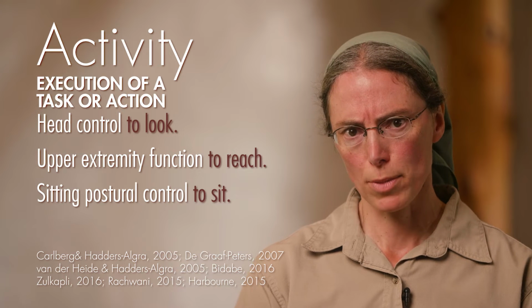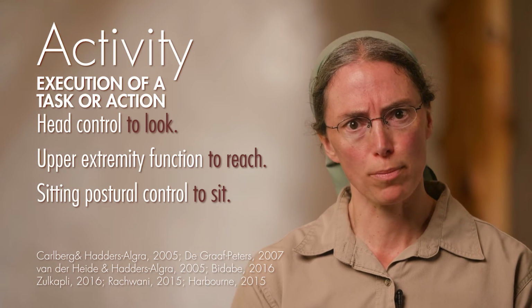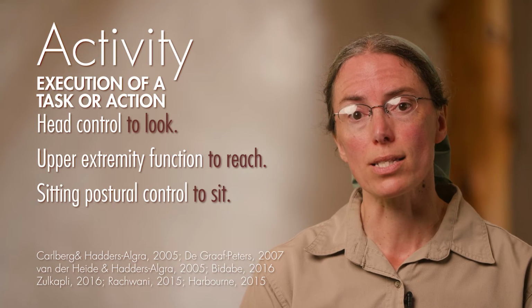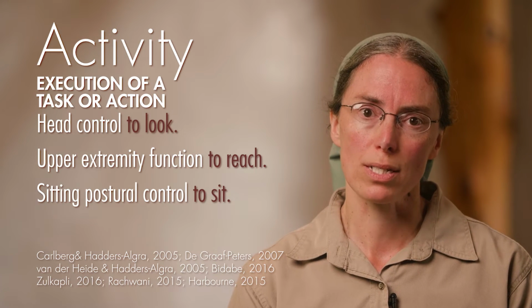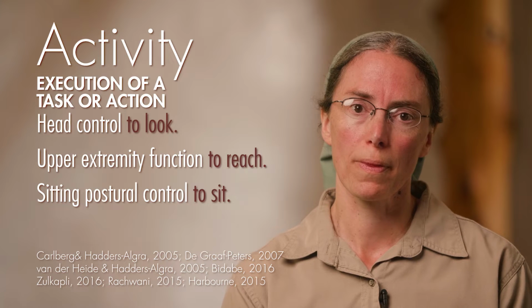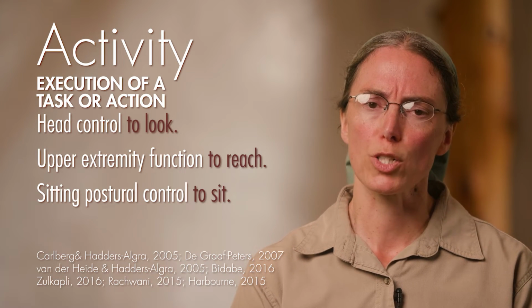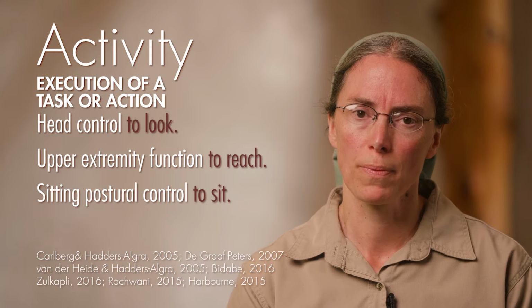Another suggestion she has is to intentionally restrain the trunk loosely in the adaptive seating, so the child perhaps begins the attempted reach with a combined arm and trunk motion, but in order to reach the desired object, would then necessarily move the arms separately and distinctly from the trunk. In this case, we are partly stabilizing or restricting the trunk to enable free arm movement.